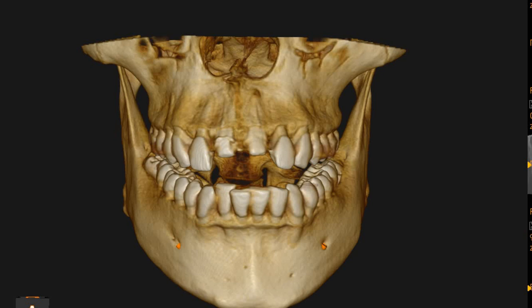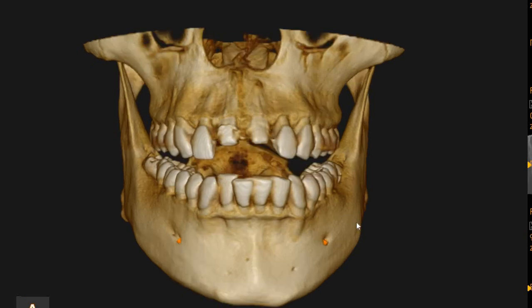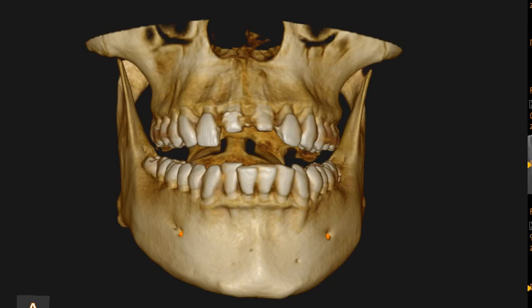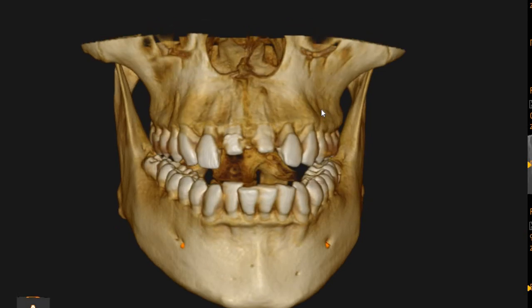Hello and Asalaamu Alaikum, Ultrascan Diagnostics. This is the CBCT of the patient that you had requested. The area of interest highlighted to us is the upper anterior region, the upper center incisors, right and left.